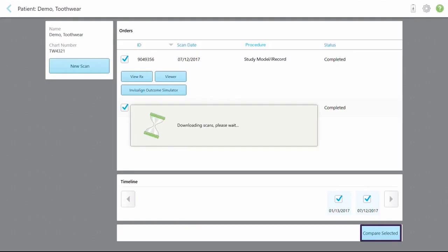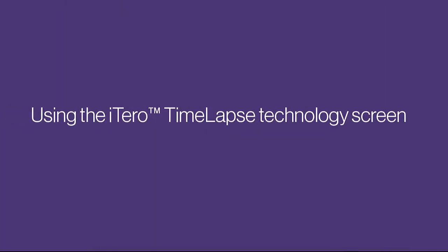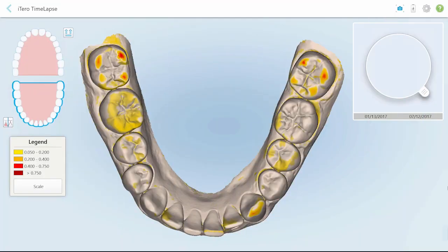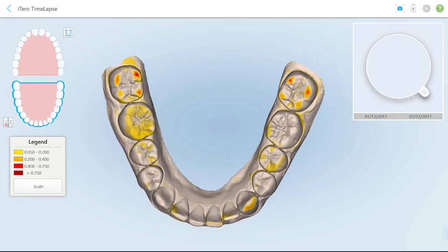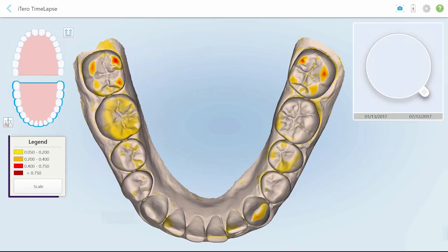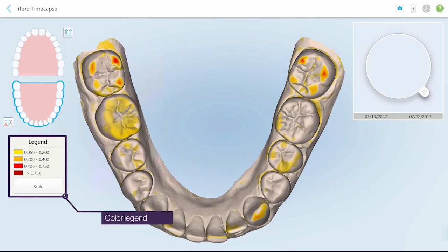Finally, tap the Compare Selected button. A 3D superimposed model of the patient scans will appear in the center of the iTero time-lapse screen, with colors highlighting the differences between the two scans.